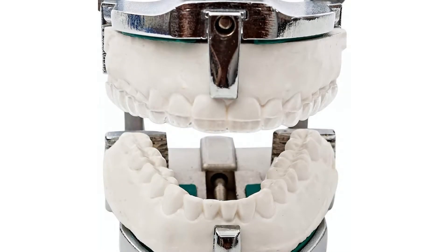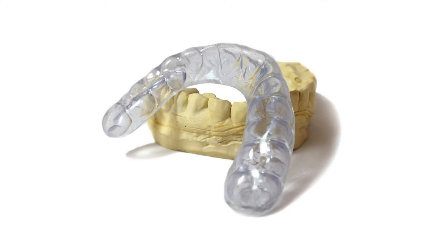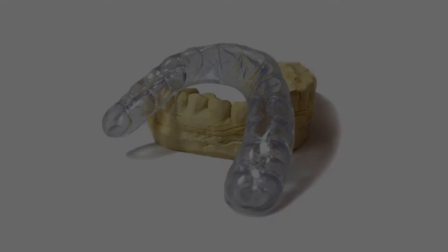Through us, you can order direct from a professional dental lab and receive the same quality custom night guard as you would from a dentist, but for only a fraction of the cost.